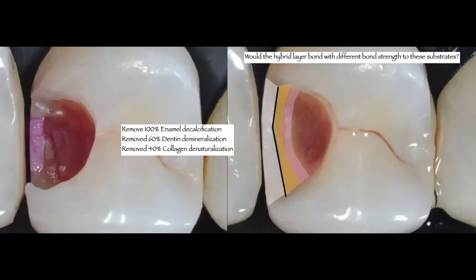And then we're going to have this area that is probably still a little bit of pink staining there. That's again 1 to 2 millimeters past that DEJ. So you still have that peripheral seal zone on the outside, where you're going to get the best bond strength. A little bit of that pinkish area, so maybe a little bit of dentin left behind, and a little bit darker pink on that axial wall that is a lot easier for you to see, that you now know is that inner caries dentin that I'm going to stay away from at this point.